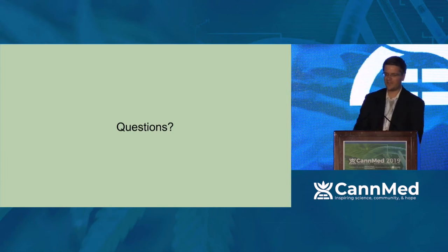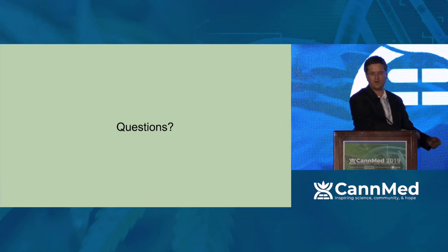Actually, yes, I have. So I found it on a YouTube video, actually, that's pretty readily available if anybody wants to look for it, of a couple very large-scale production labs that have automated media pouring techniques that they do. So it'll pre-make the media in the autoclave and then pipe it as a flat moves along a line. And that flat fills every single tube, and all of a sudden you don't have anybody filling tubes. You have people picking them up, setting them on the rack, and pulling them off the rack pre-filled.